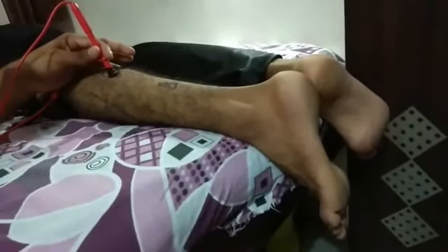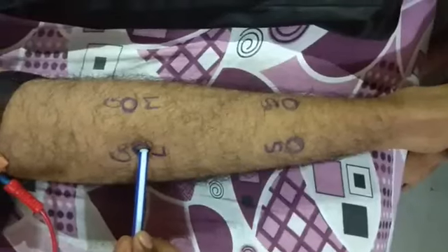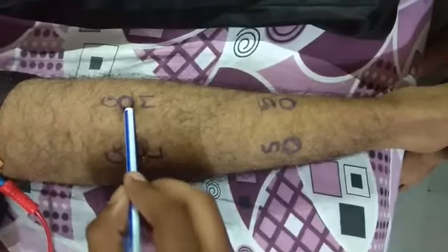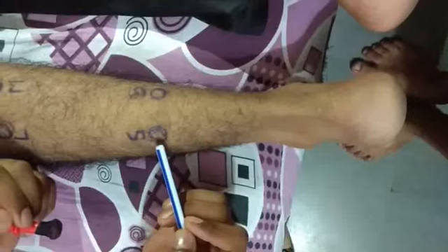This is the motor point of the lateral head of gastrocnemius. Action: plantar flexion of the ankle joint. This is the motor point of the lateral head of gastrocnemius, and this is the motor point of the medial head of gastrocnemius. This is the motor point of the soleus muscle, which is plantar flexion of the ankle joint. This is the motor point of the soleus muscle, both sides.